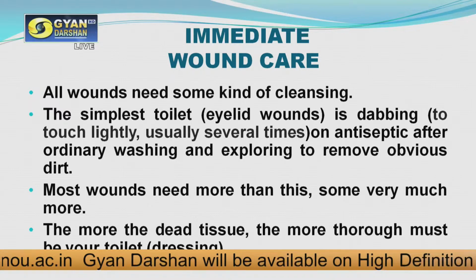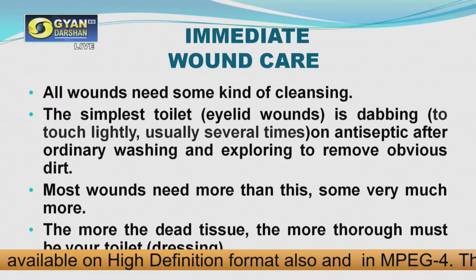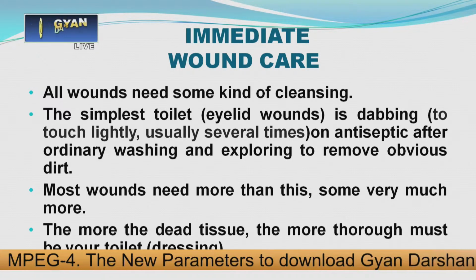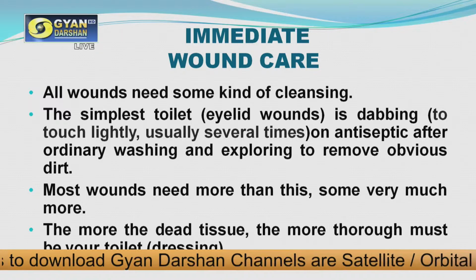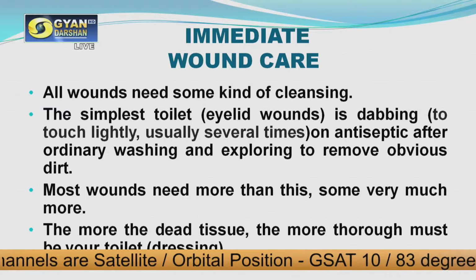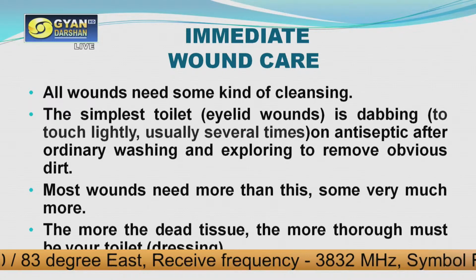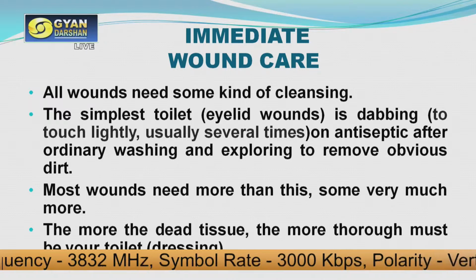So let us see the immediate care of the wound. As you know, all wounds need some kind of cleansing, or we can also say toileting, because even the simplest wound, which is on the eyelid or on the face or arm, needs to be cleaned. So after you do the thorough cleansing with the help of soap and water, followed by that you can use some antiseptic on the swab and do the dabbing.